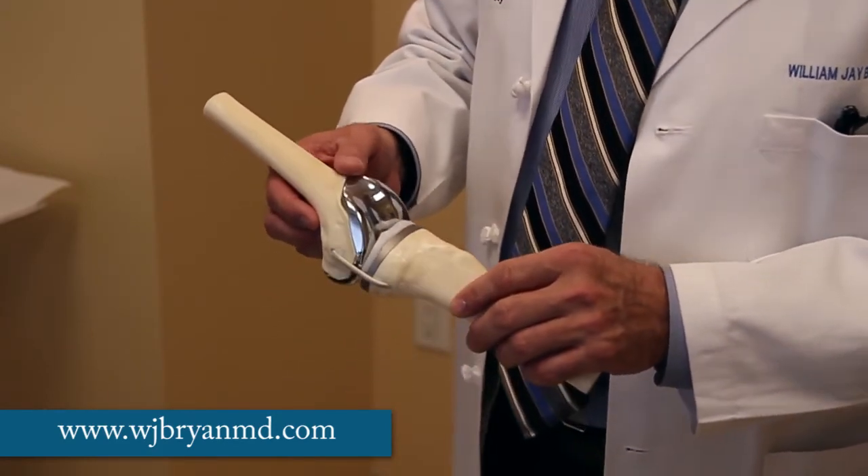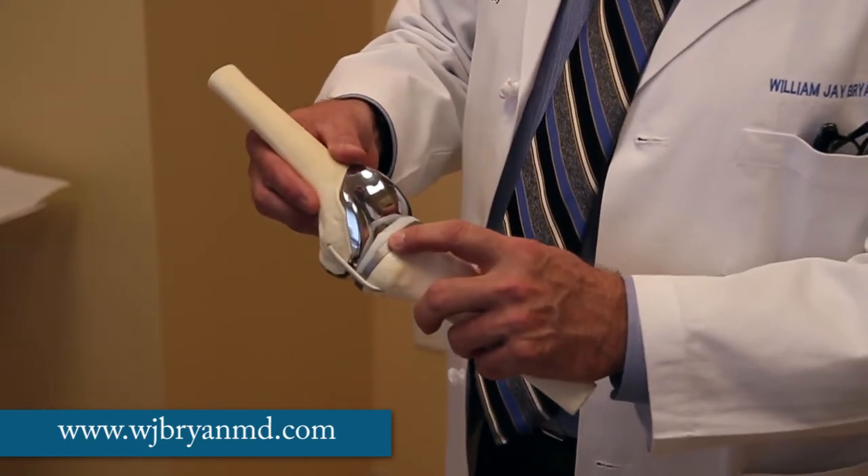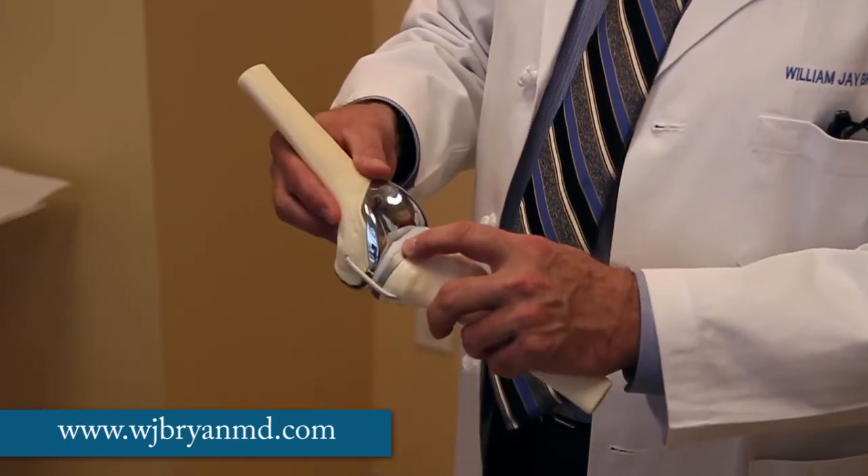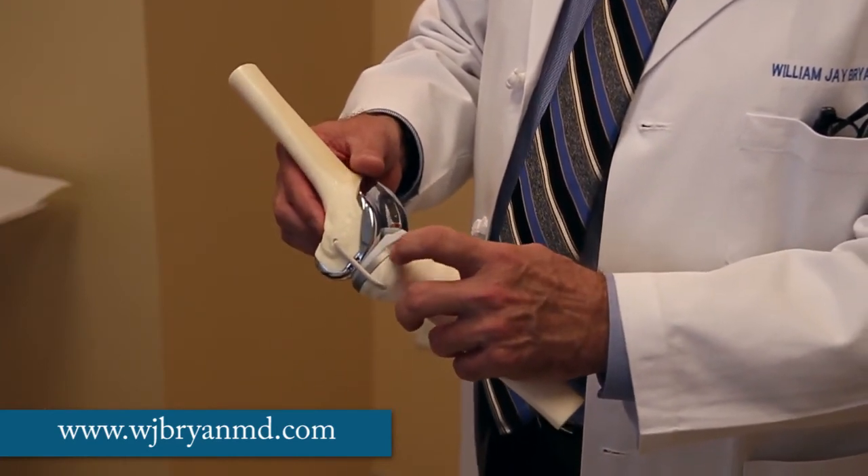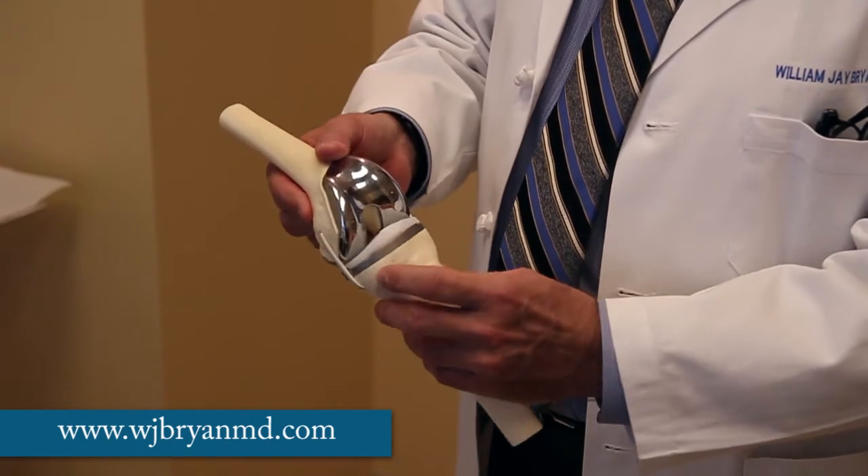The result of all this is that your body is not going to feel the load and the motion of the knee joint, because the nerve endings are now protected with the metal and plastic that has been inserted.